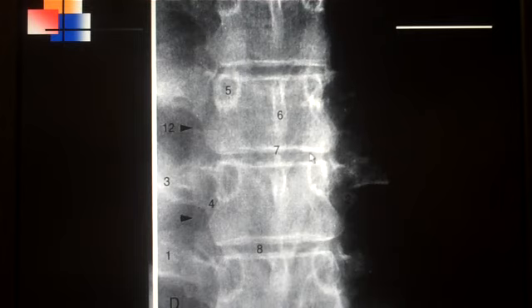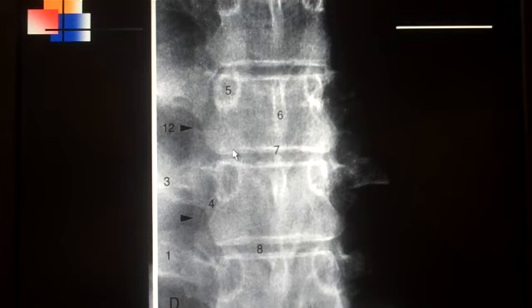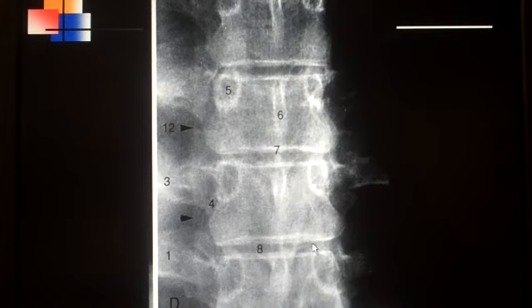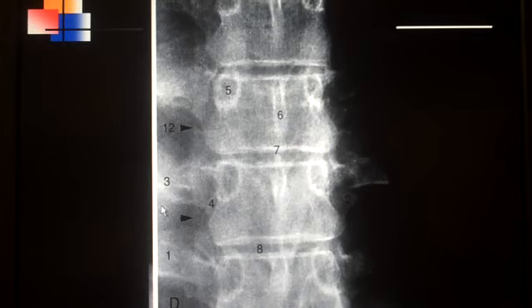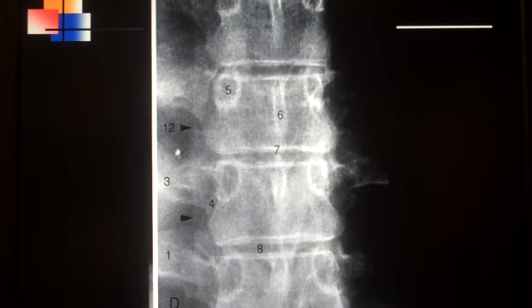Number seven is the inferior vertebral end plate right along right here, and number eight is labeling the intervertebral disc space. Looking at number 12 with the black arrows right along right here, that is called the paraspinal line. Basically this is inside the lung field and this is outside the lung field, and that's why this area is just a little bit darker in density because the air in the lung has no density.